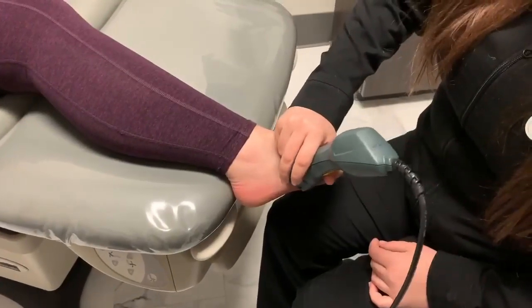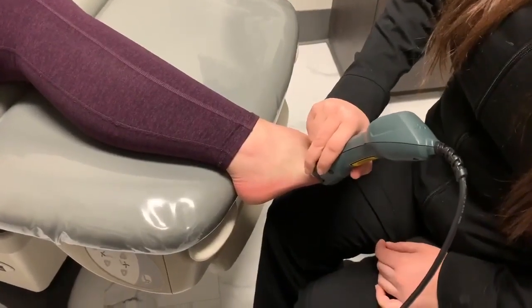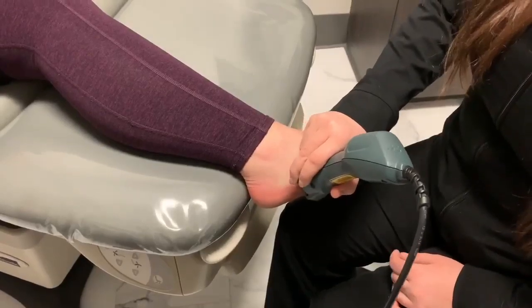Victoria is going to demonstrate how we do it on this patient. She's working on the outside of the patient's foot — the patient has peroneal tendon pain that runs all the way up the outside of her foot and into her ankle.